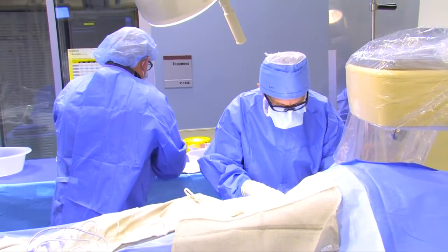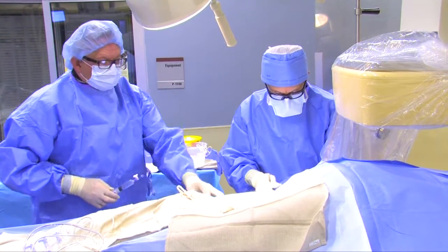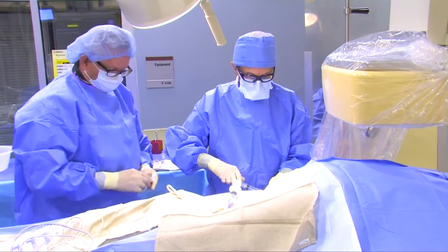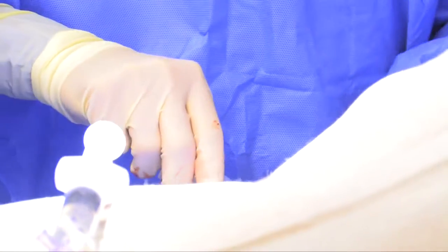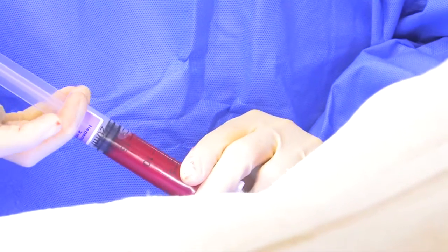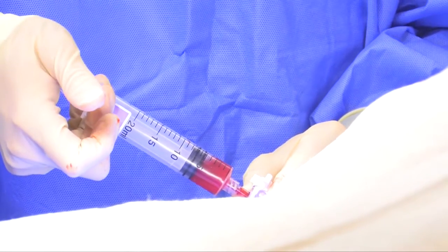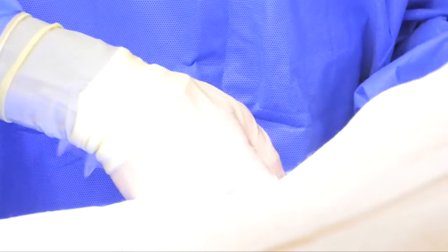The sheath allows us to pass other catheters through it. These are the catheters we use to image the coronary arteries — they have special shapes adapted to get into the artery. Since we have a foreign piece of plastic in the artery, we need to make sure the artery doesn't clot or spasm. Once we get access, we inject medications that prevent spasm and blood thinners that prevent clot, because we're dealing with a tiny little artery.